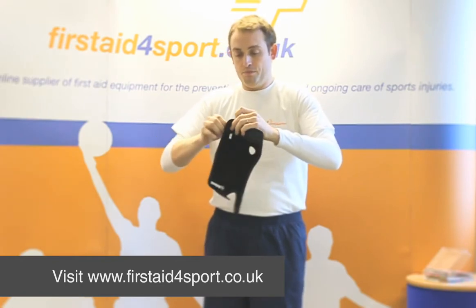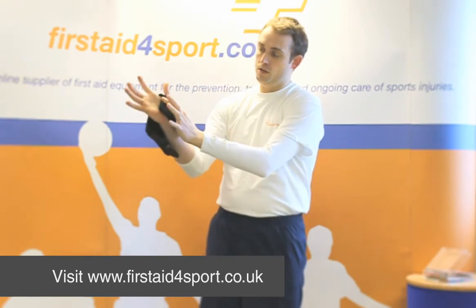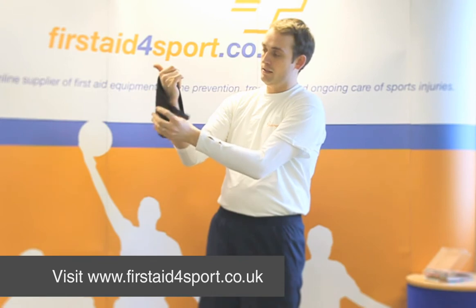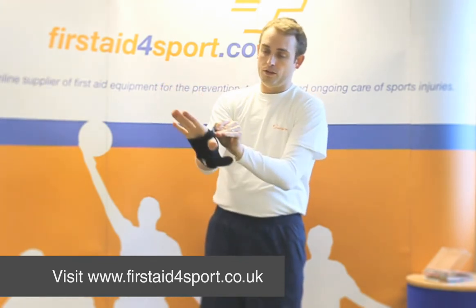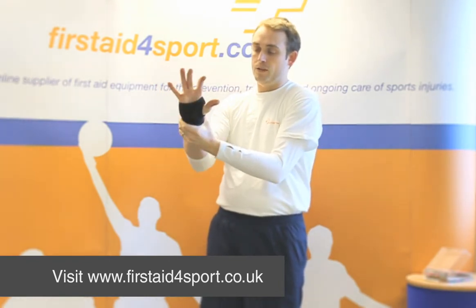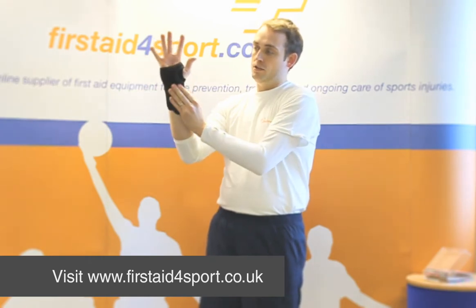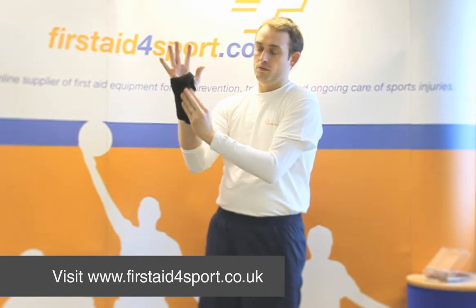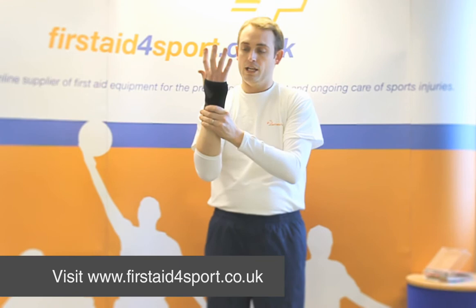So you pop the stay back in, your thumb goes through so the splint is on the inside of your hand, the top strap goes over the top of your thumb, and then you pull the wrist strap as tight as you feel comfortable. It then offers your wrist some movement but with support from the rigid stay and also from the material of the brace.